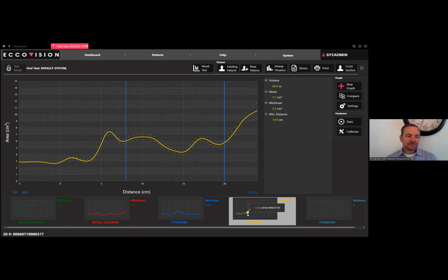Goodness. Well, the minimum went up to 4.3. Yeah, so that's how much 1 or 2 millimeters can make an airway. Wow. No protrusion, end to end in the anterior, 6 versus 8.